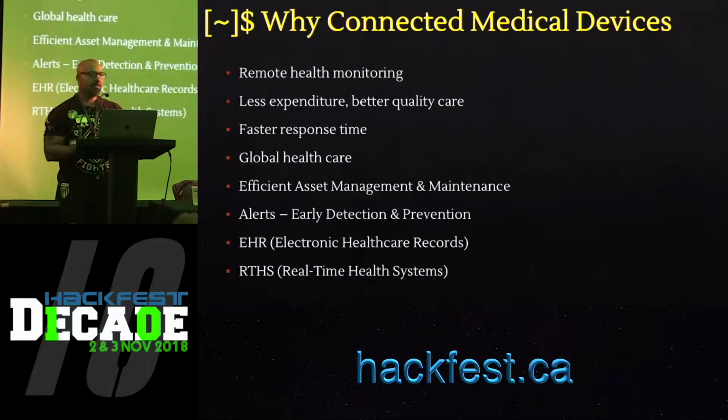onto. And then if the hospital decides to share the data collected from the infusion pump, they can do so by pushing the data out onto the cloud server, or giving researchers access via VPN. So we've seen both kinds of cases.